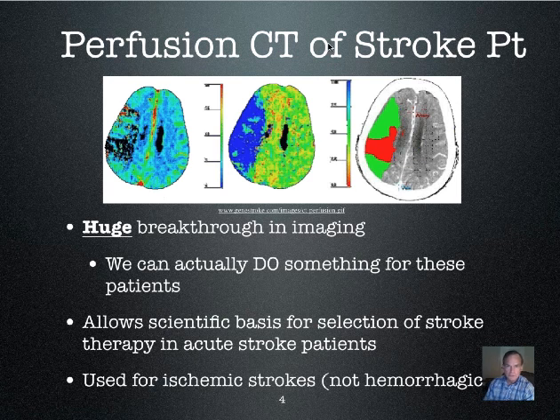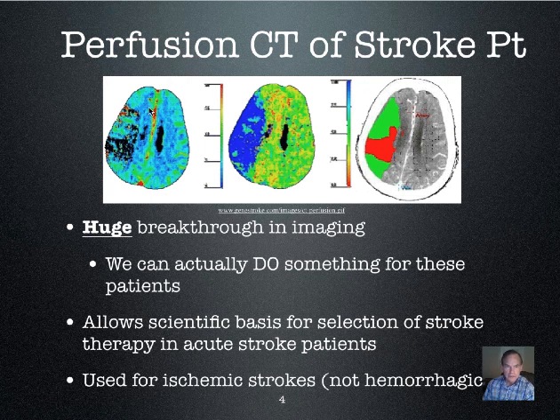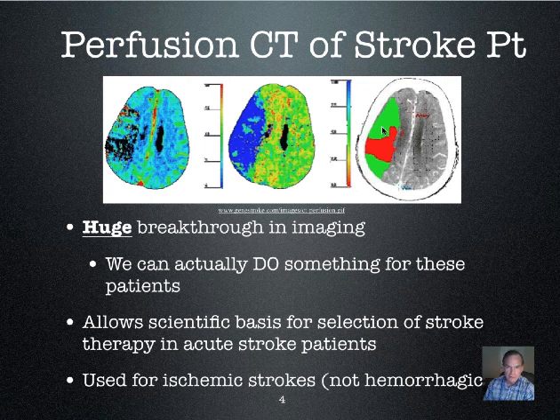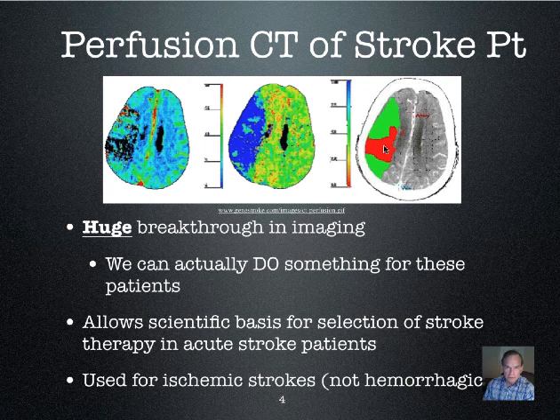This is showing a perfusion CT of a stroke patient. Through computer analysis we are able to determine how much of an area of abnormality in the brain is permanently destroyed and how much is reversibly affected. The red area is what the computer has calculated to be irreversibly affected, stroked-out tissue, and the green is potentially reperfusable and salvageable.